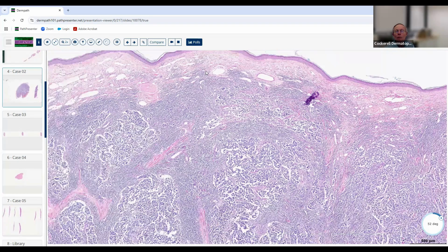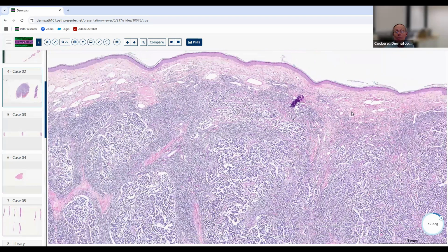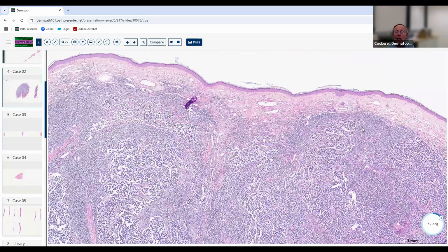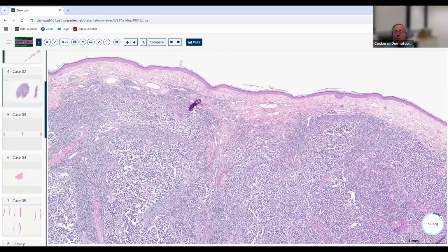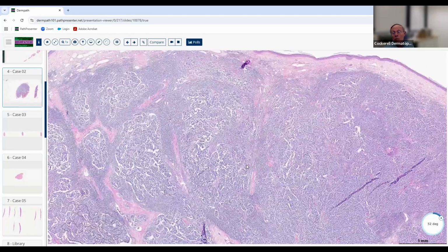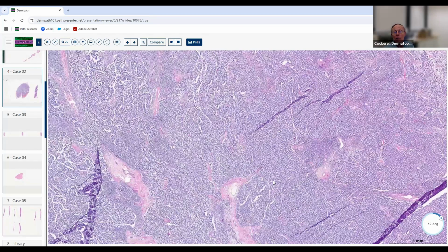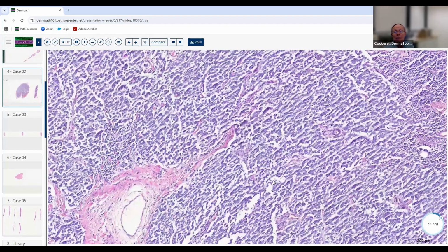I mean, it doesn't have any involvement in the epidermis. We can't say it's not maybe a recurrent Merkel cell, that maybe they had one near the site and it recurred locally at the area because it underwent a satellite metastasis. But it still could possibly be a primary Merkel cell carcinoma. So we're not really sure about that. All we can get into is the category of malignant neuroendocrine neoplasm here.